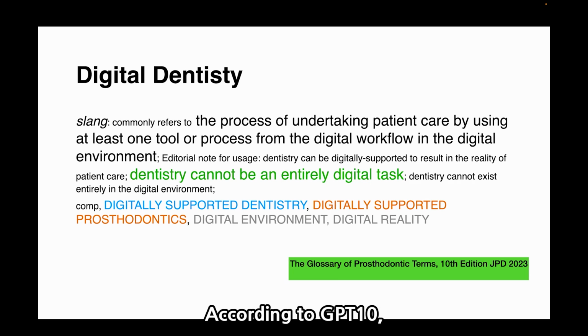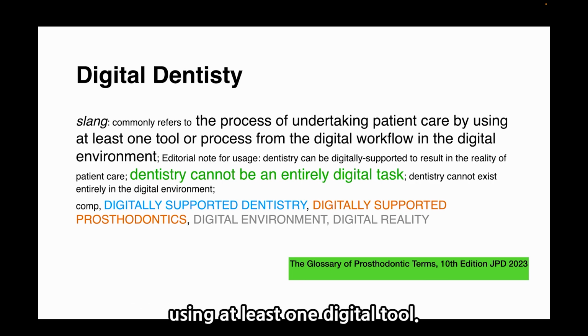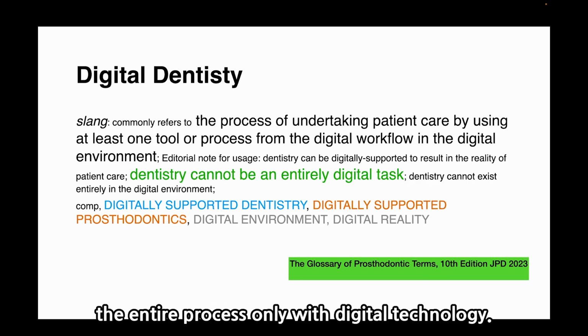According to GPT-10, digital dentistry involves treating patients using at least one digital tool. However, this does not mean completing the entire process only with digital technology.